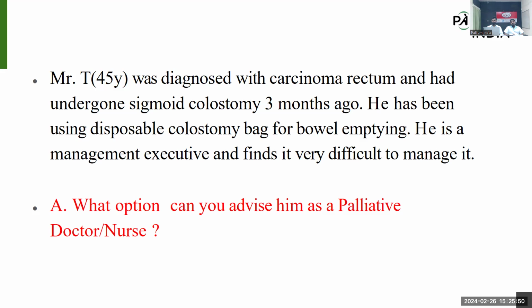Use other bags. Okay, using other bags means whenever the bag is half filled with fecal matter, he needs to go to the toilet and change the bag. That he knows, and he has adequate bags with him. So only due to the tight time schedule, he can't go and change the bag.